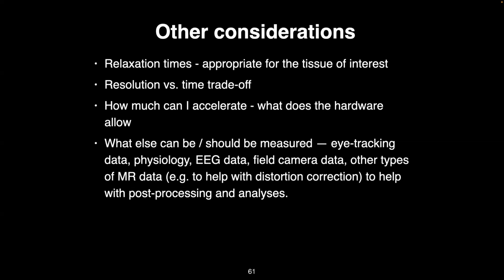So just keep in mind, there is a cost to collecting more and more. It's complexity, it's making sure things work all the time, setup. So a lot of times, it's good to figure out upfront what is good for me to collect to do this robustly, repeatedly.